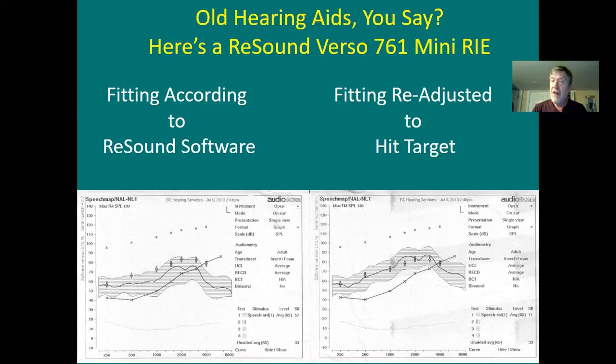manufacturer software gets us into the ballpark. It gets us toward where we've got to go. We as clinicians have to finish the job with Real Ear. This is not taught well enough by places like the International Hearing Society. This is not practiced enough among our peers out there in the real world.